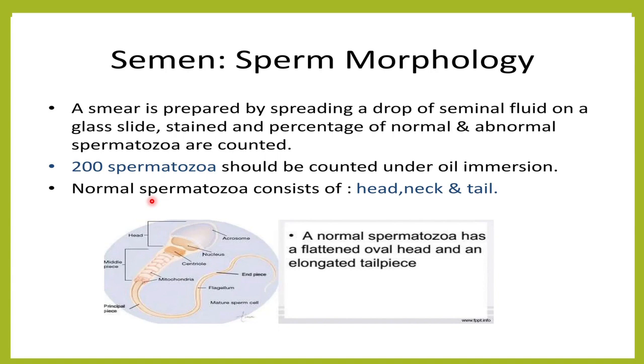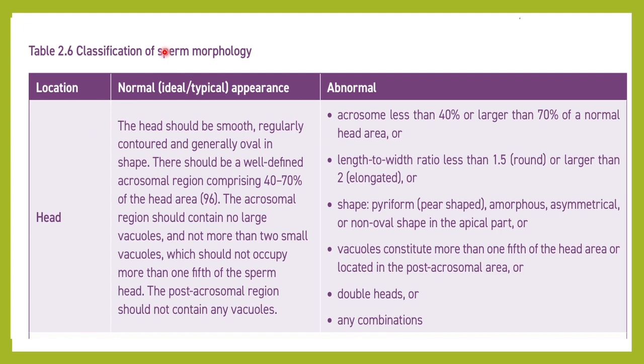I'm Dr. Divya, and in today's class let us see what are the various abnormalities in the sperm morphology that we can pick up on the slide. See, the WHO has classified the sperm morphology on various strict criteria.